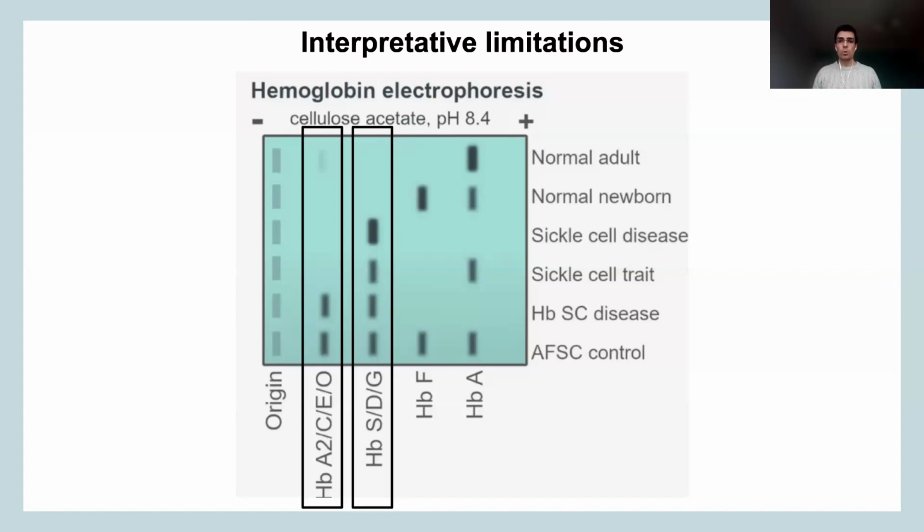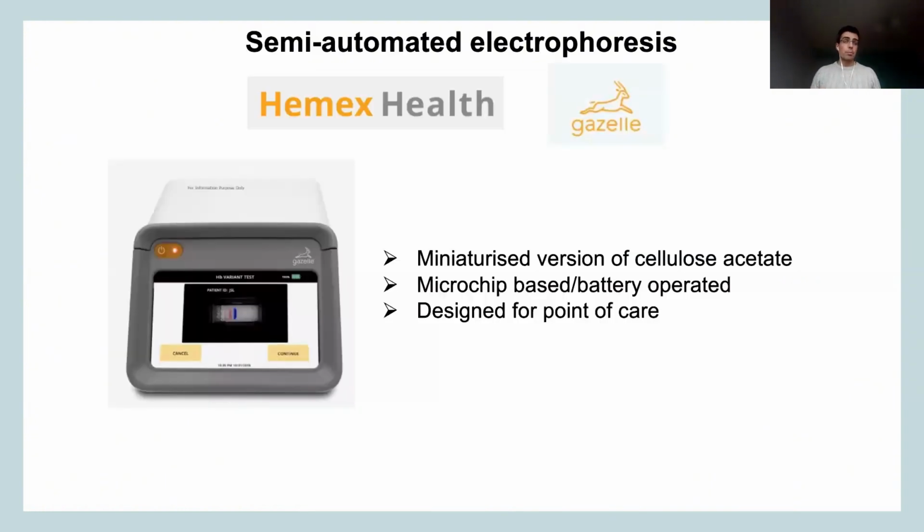So it's quite important to know those limitations and possibly have a secondary line of tests, so you could bypass the possibility of misdiagnosing hemoglobin variants that you're detecting in alkaline electrophoresis. Times have progressed, and even being a more simplistic technique, it can be coupled to a more automated way, and its sensitivity can be increased if you put it into an analyzer. I call it semi-automated electrophoresis, because there's still a manual component you need to participate in.